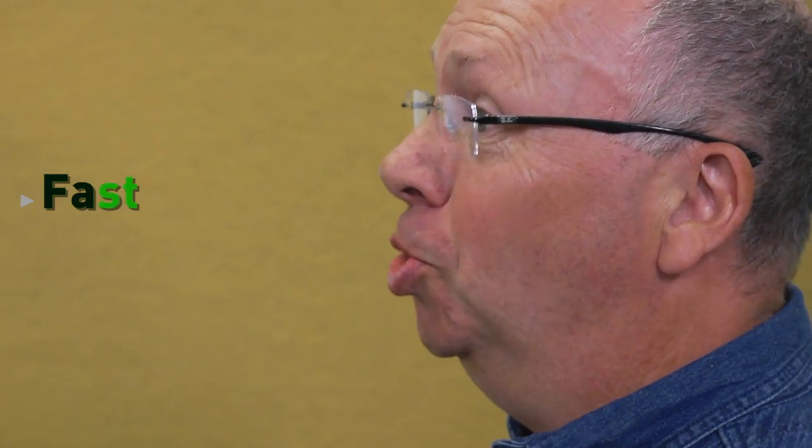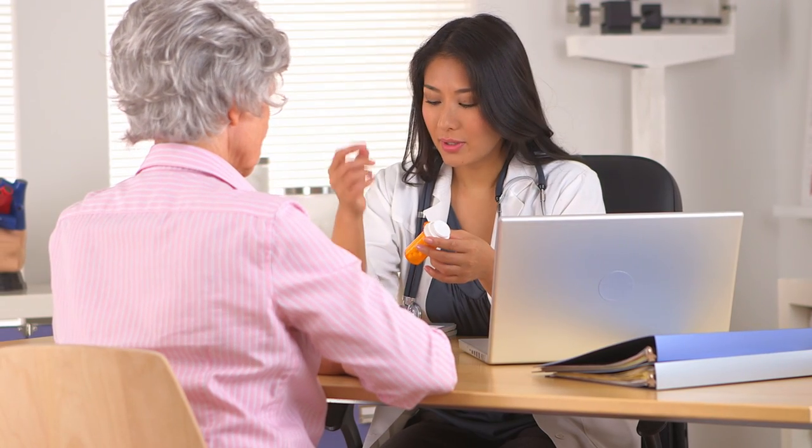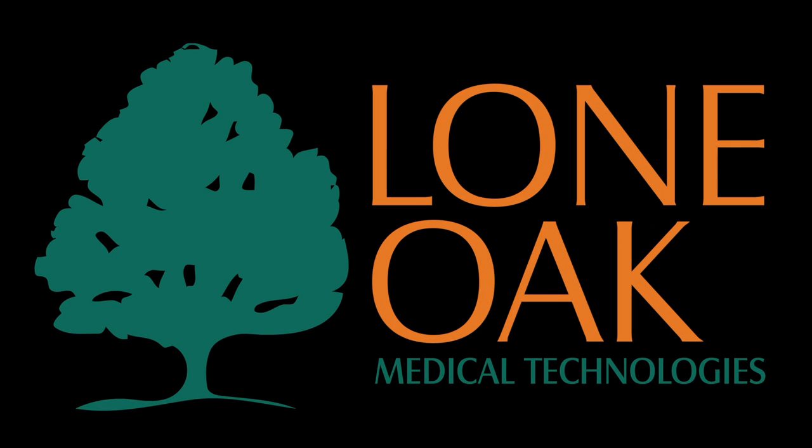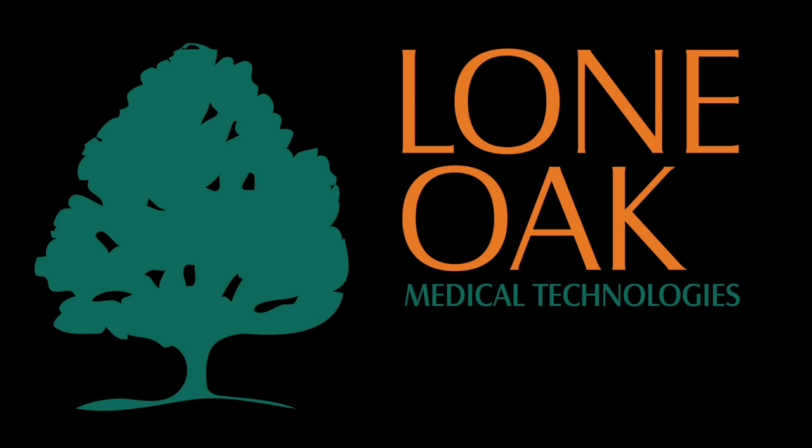The AcuDexa 2 is fast, it's easy, and it's accurate. It's covered by most forms of insurance, including Medicare. With the lightweight and compact AcuDexa 2, early detection of bone density loss epitomizes the future of every general medical and healthcare practice. Lone Oak Medical Technologies — the hands-down leader in bone density screening.